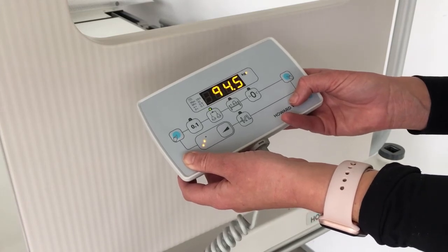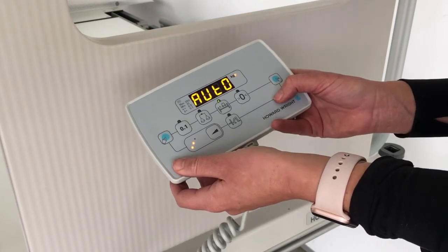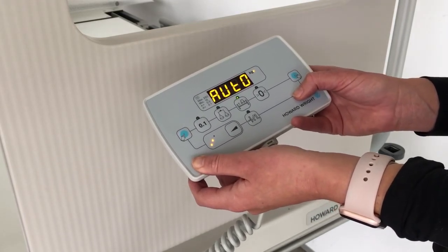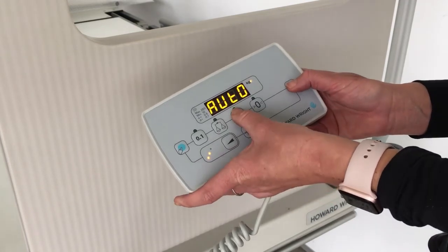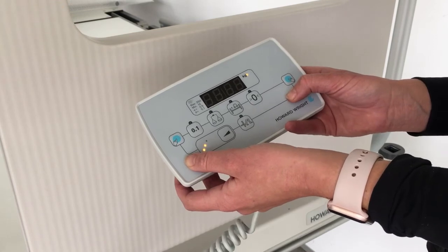To add or remove weight from the bed, press the add/remove button. Once the display panel reads auto, add or remove the weight from the bed and then press the add and remove button again. The original weight will be displayed when the weigh function button is pressed.